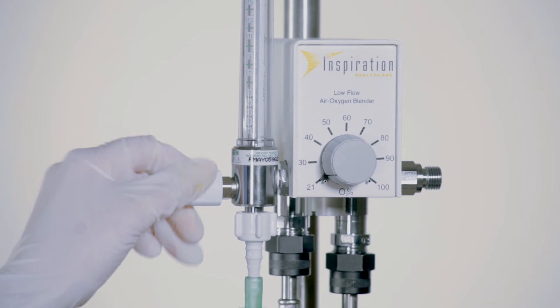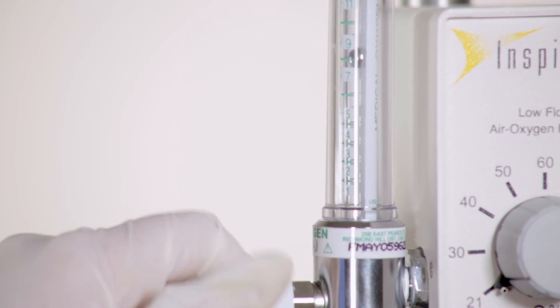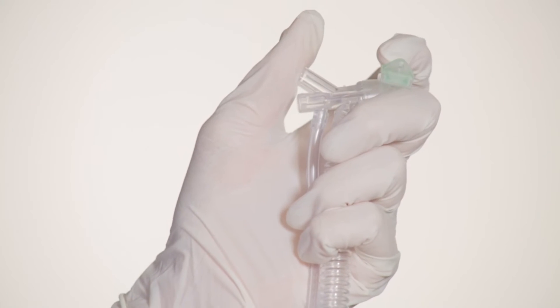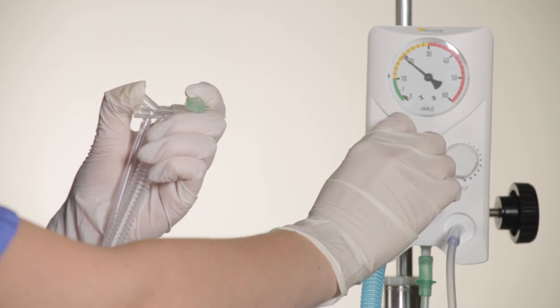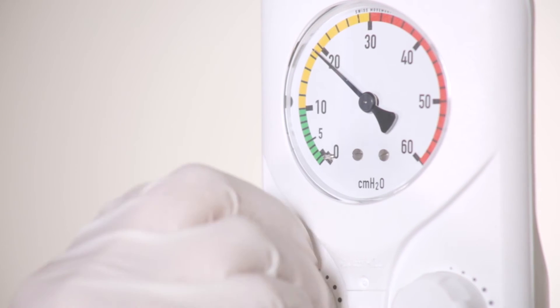Next, set the flow and pressure settings for the infant. Set the flow meter to the required flow rate, up to a maximum of 15 litres per minute. To set the PIP, occlude the nasal prong interface, ensuring a nasal prong is fitted. Occlude the gas outlet and turn the PIP control knob until the desired PIP level is set.